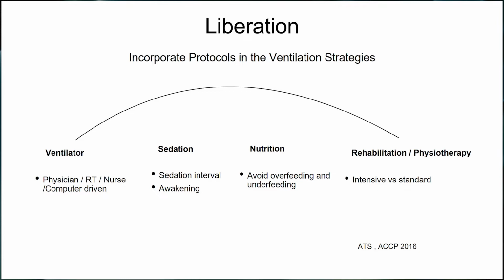So with respect to liberation from the mechanical ventilator, the various aspects of ventilation, for example, the kind of mode you use, when do you subject the patient to a spontaneous breathing trial, who should do it, if you have a protocol which guides these things at your ICU, depending upon the infrastructure that you have, it could be physician driven, respiratory therapy driven, or nurse driven. Having a ventilator protocol which clearly guides about these principles can significantly decrease your length of mechanical ventilation stay.